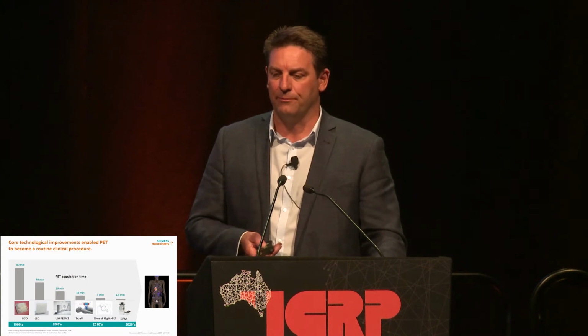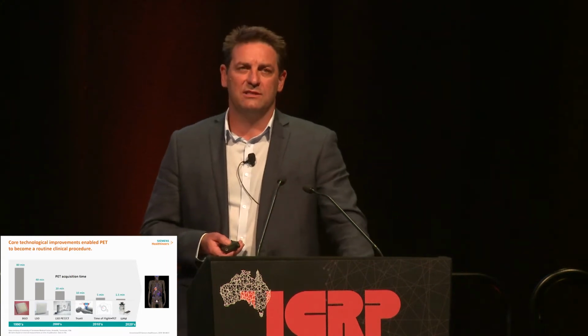In reality, what we're seeing in clinical practice is that there are improvements in image quality, but we're also seeing a corresponding decrease in dose in most cases, and I'll give some examples of that later on. So BGO systems were commonly commercially available in the early 1990s. There were systems prior to that, but the first really commercial PET scanners were available around that time.